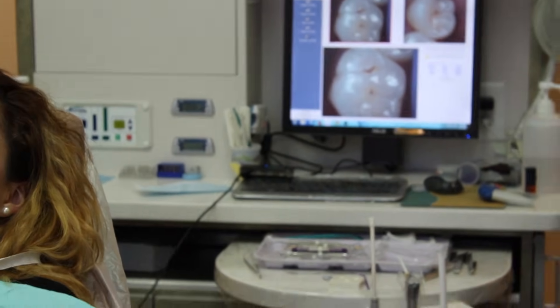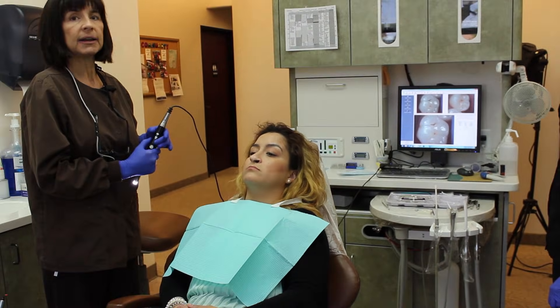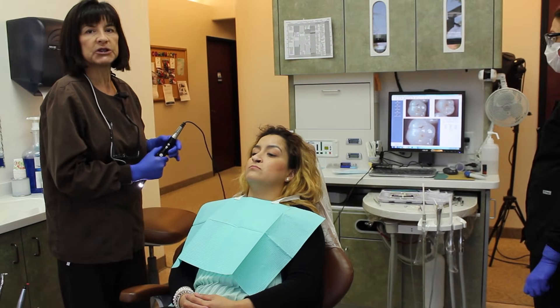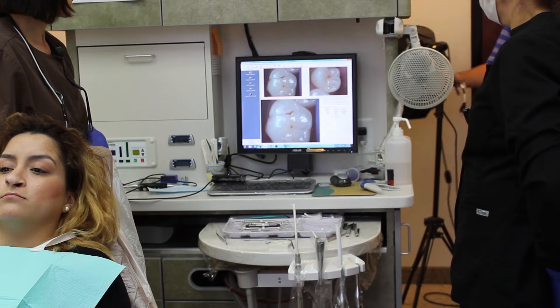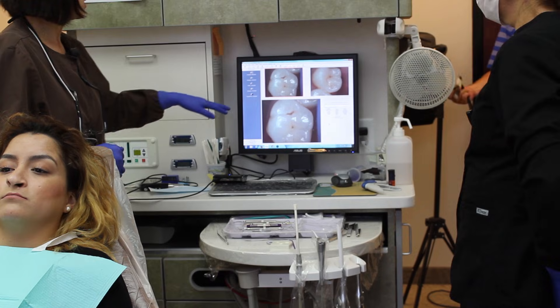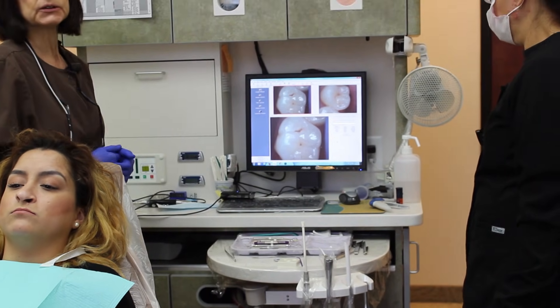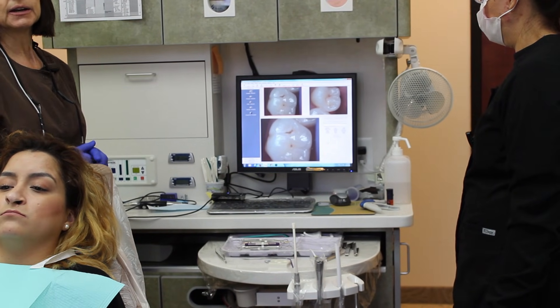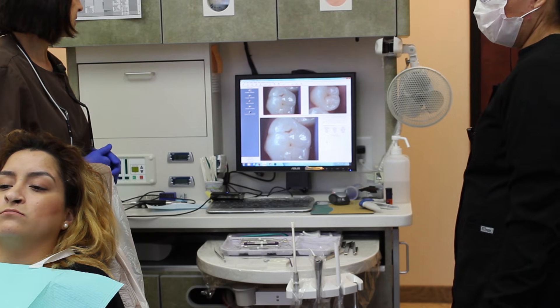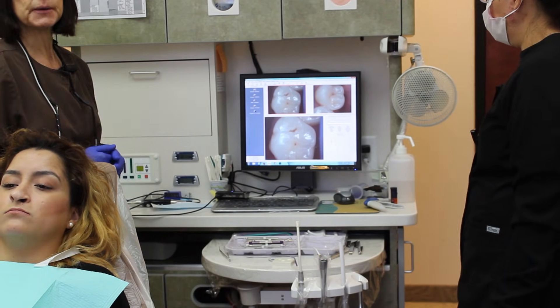I can often get the filling done without giving my patient a shot, because I'm going to use air abrasion to remove the cavity. Often times a cavity like this won't be treated at an early stage, and that's the advantage of air abrasion — I can easily treat this without any discomfort to the patient.